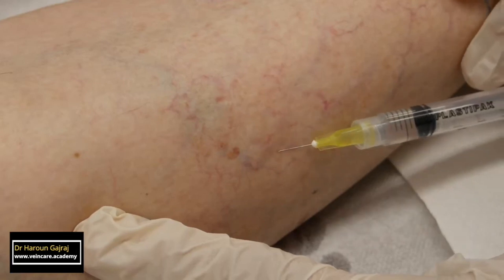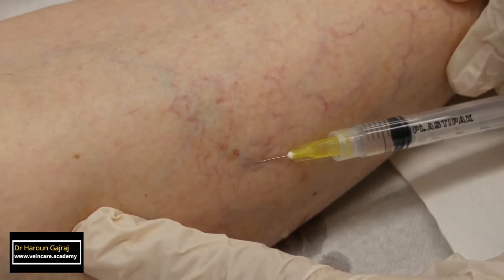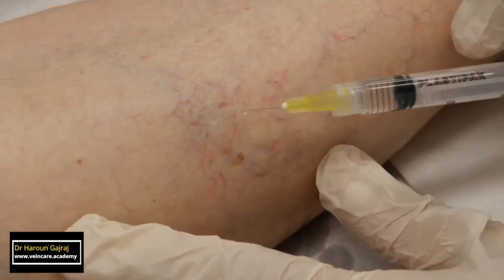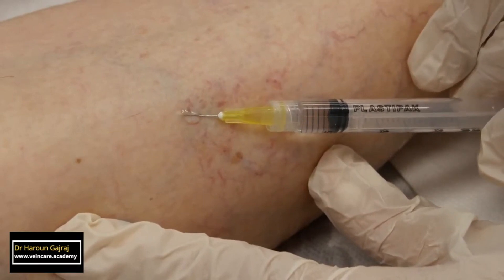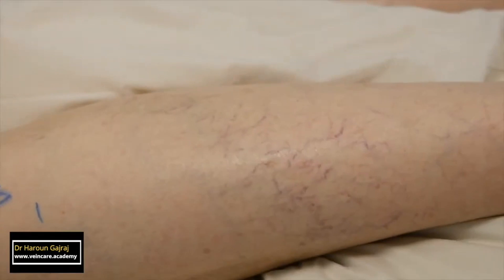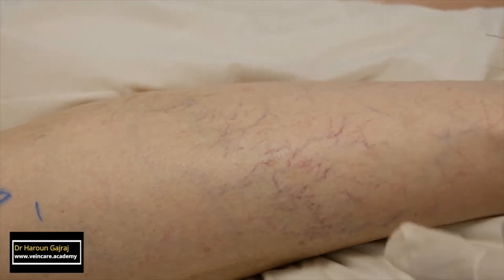Not all injections are successful, and here you can see a small bleb. A bleb represents extravasation of the sclerosant outside the vessel, and it indicates that the injection must be stopped immediately. Notice that when I cause a bleb, I move on to another injection site as soon as it appears.